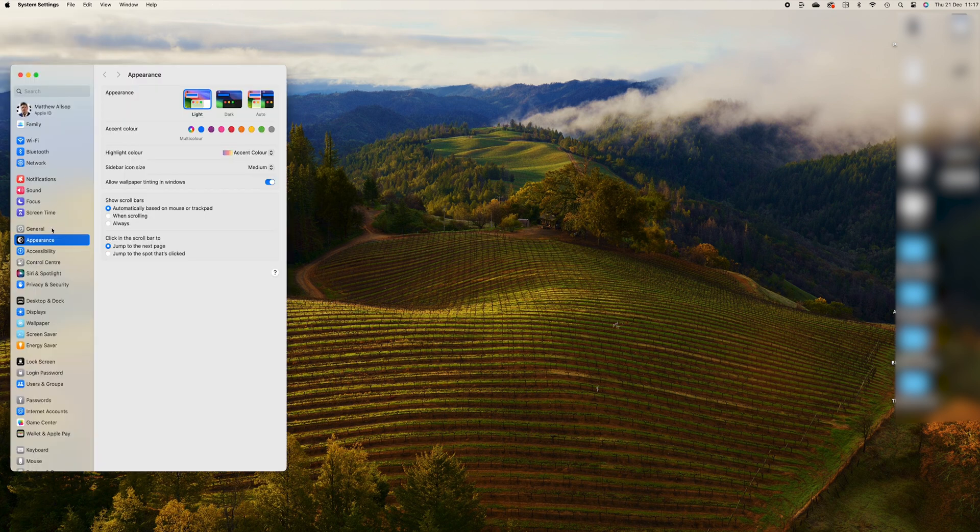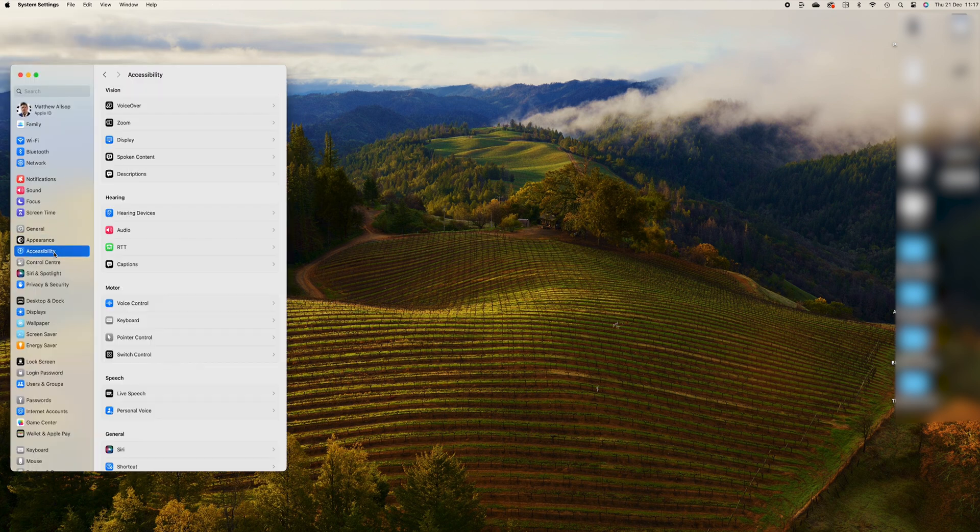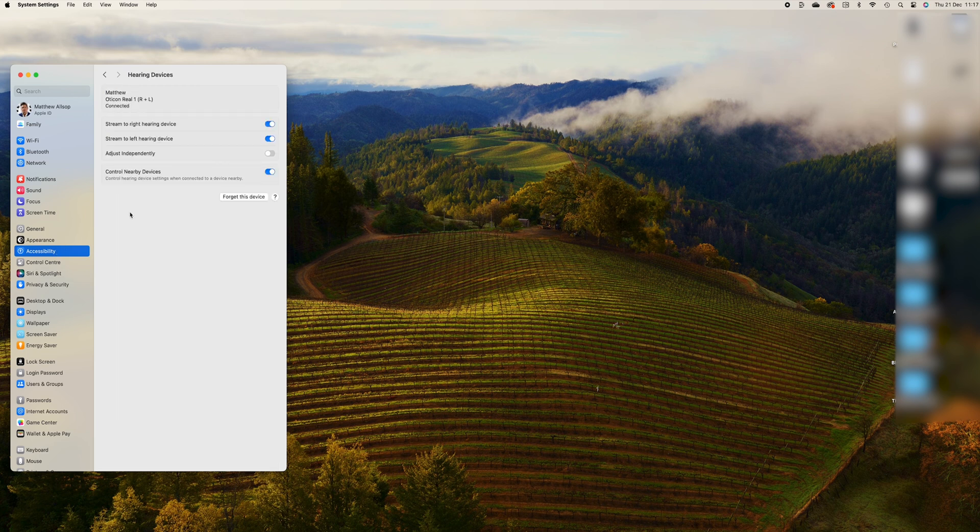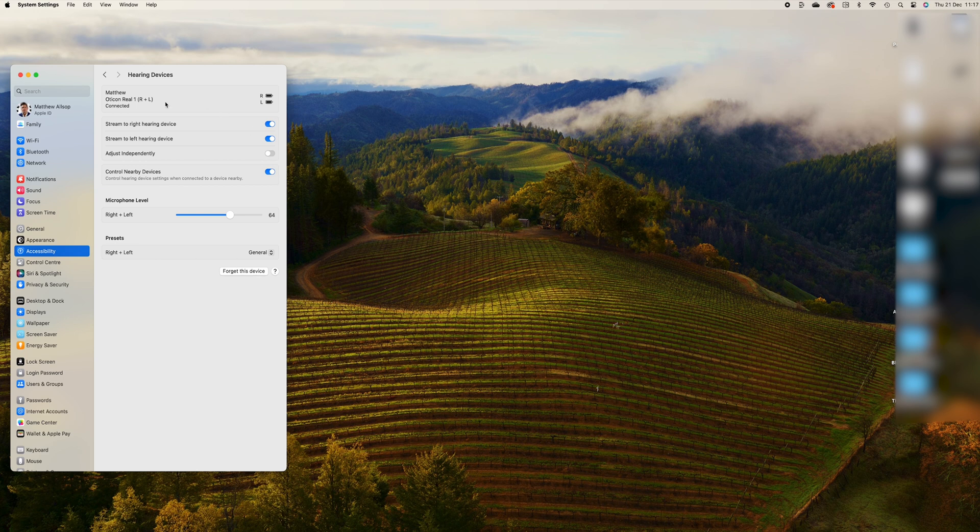On the right-hand side under the Hearing menu, I want you to then click on Hearing Devices. You should now be able to see your name and hearing aids on screen.